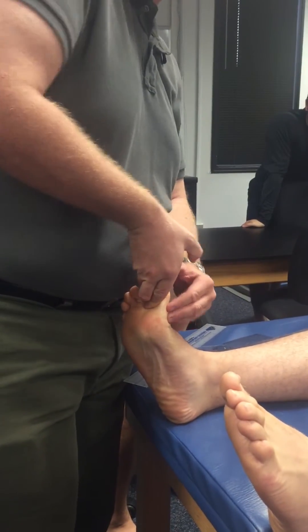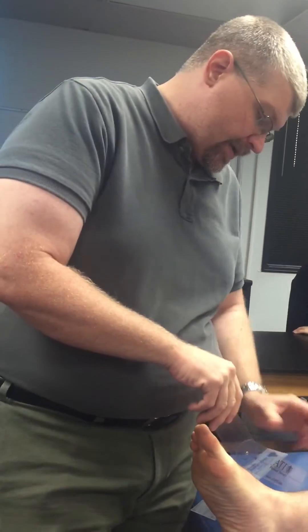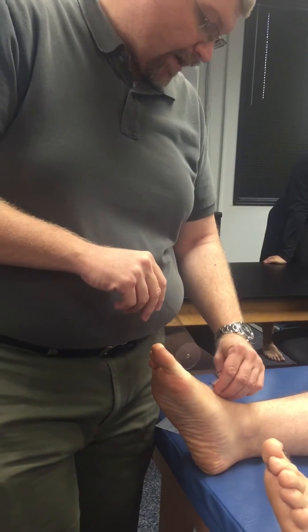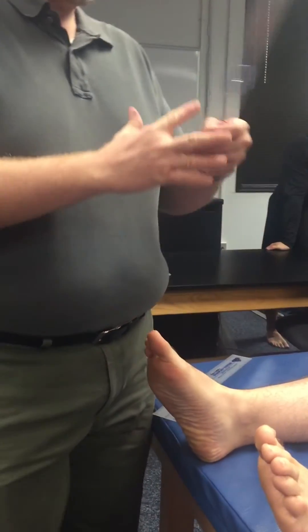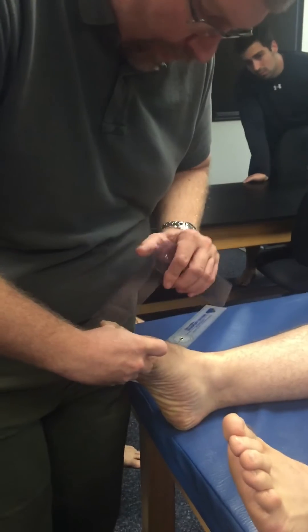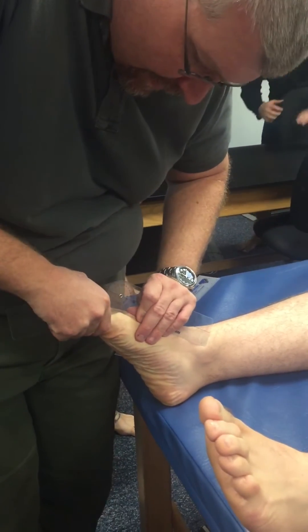His measurement, because he does get through that arbitrary zero, is going to be from zero to whatever number I get. Your book shows goniometers — these ones get a little long because the length hits the top of his leg. Remember when we did the fingers: you've got to be parallel with that toe, so having shorter goniometers becomes important here. Your book shows those cut-off versions.